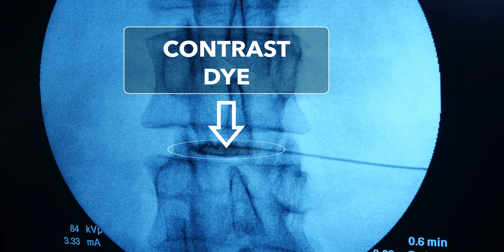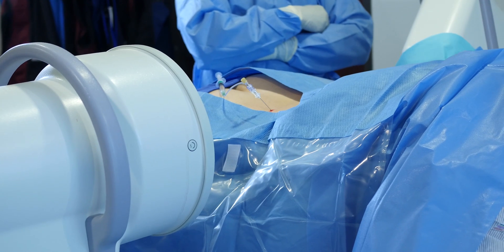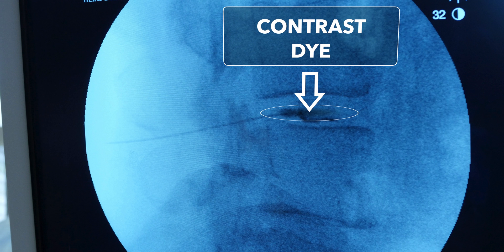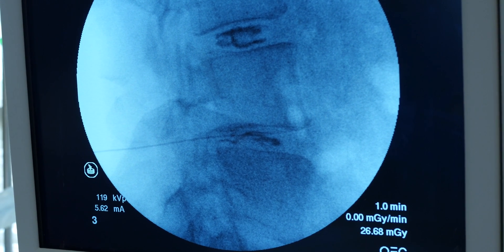We're going to confirm this with two different views. This is the AP view — it looks like there's perfect flow inside the disc. Now we'll obtain a lateral view to confirm that. The lateral view is also diagnostic, in which we can see if contrast extravasates into the area of the tear, which is precisely where we want to inject our biologic, and we can grade the level of the disc tear.